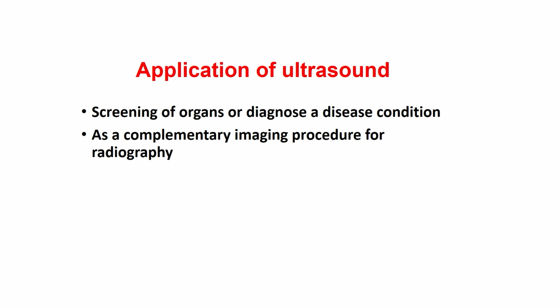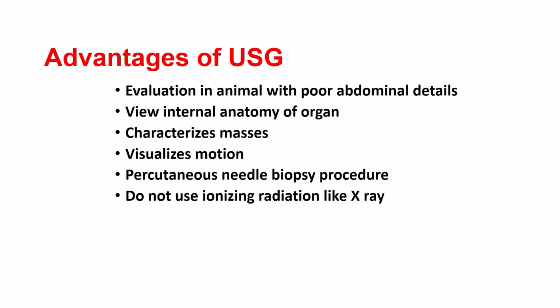Let us discuss the application of ultrasound. Nowadays ultrasound is widely used to diagnose disease conditions, especially related to soft tissue, and we can screen the organ with the help of ultrasound. Ultrasound always acts as a complementary imaging procedure for radiography.